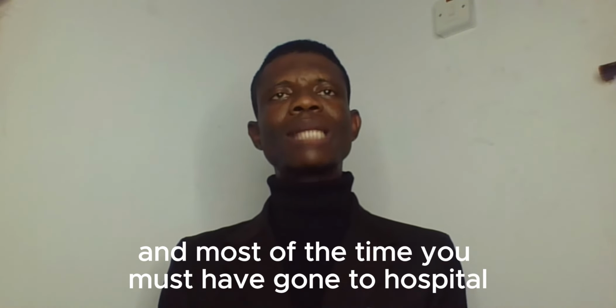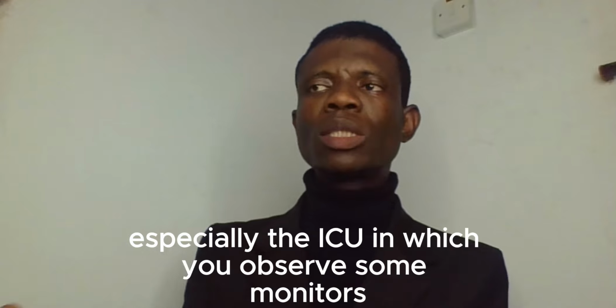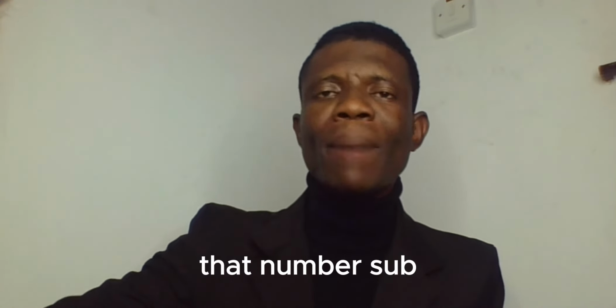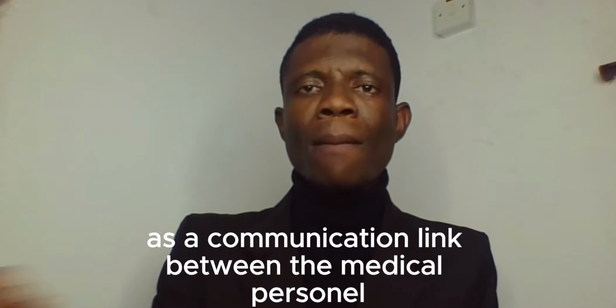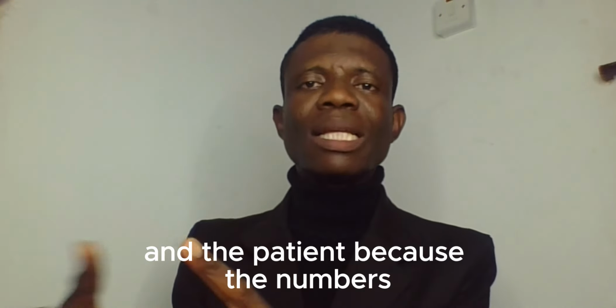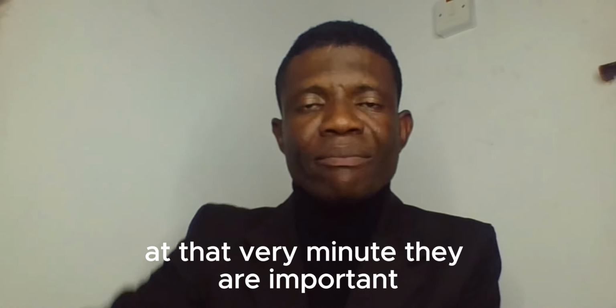Most of the time, you must have gone to hospital, especially the ICU, and observed some monitor having some numbers. Those numbers serve as a communication link between the medical personnel and the patient, because the numbers tell you what is actually going on in the life of that patient at that very minute.